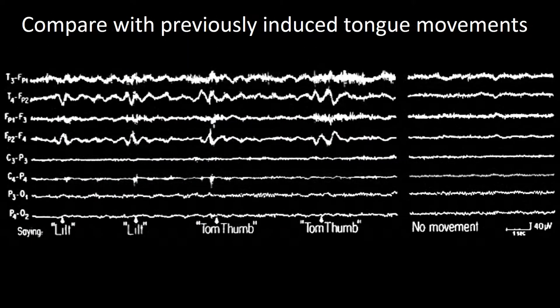Different things can be done to avoid confusing a glossokinetic artifact with a seizure. One thing is to have the patient move his tongue at the beginning of the EEG recording. This is usually done by asking the patient to repeat certain words and seeing the impact in the recording. In this frame, the artifact produced by repeating certain words is shown.